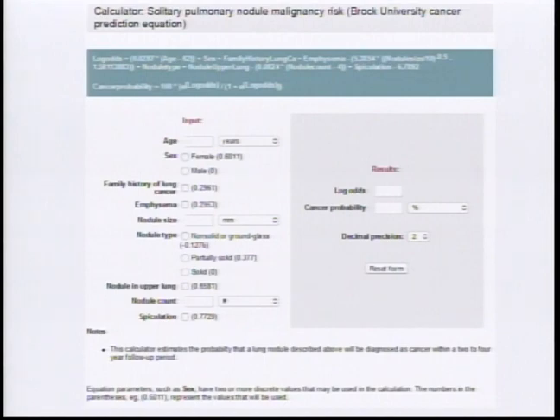This case was obviously a very high risk. It was probably 85% probability of malignancy based on the emphysema and the size of the lesion. And so you could argue, well, why not just take it out? Many of these patients have bad emphysema, and so they're not operative candidates, and so that's when a biopsy makes sense. The traditional indication for a lung biopsy would be someone with an intermediate probability where you're not really sure, it may not be worth the trip to the OR, but a confirmatory biopsy is desirable.